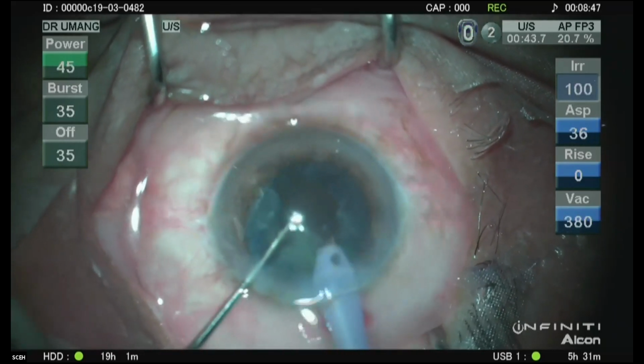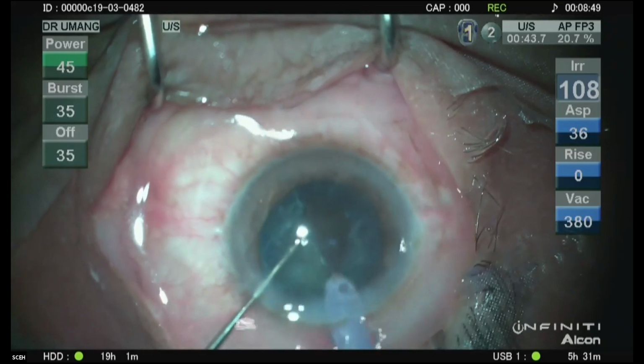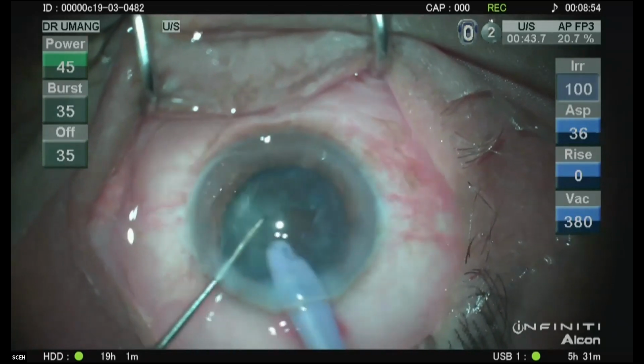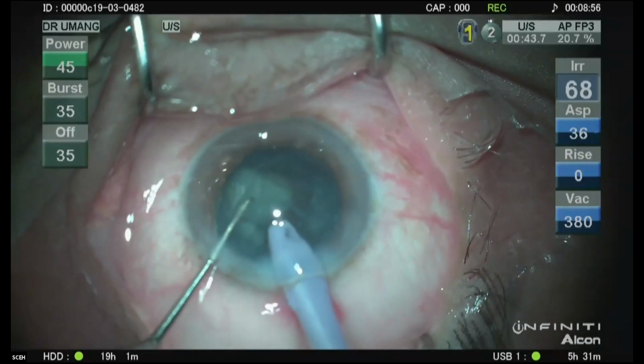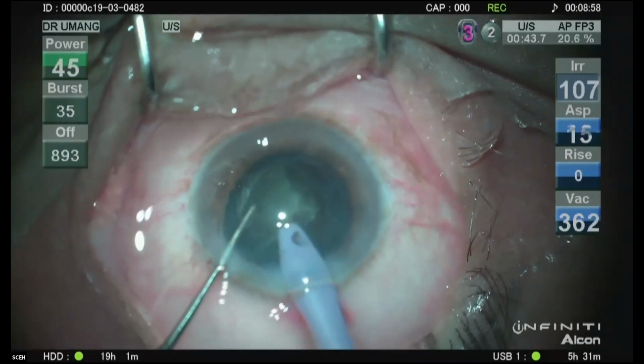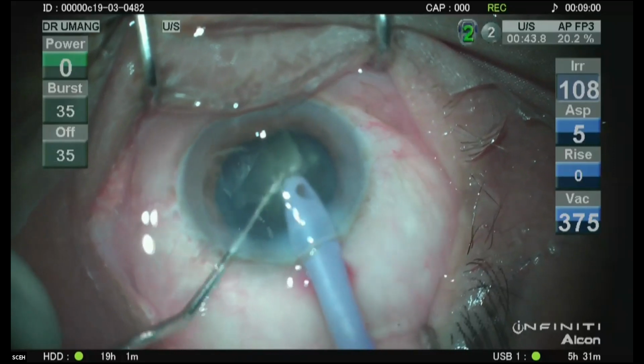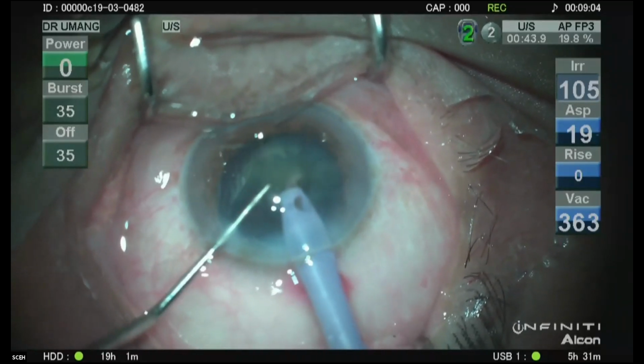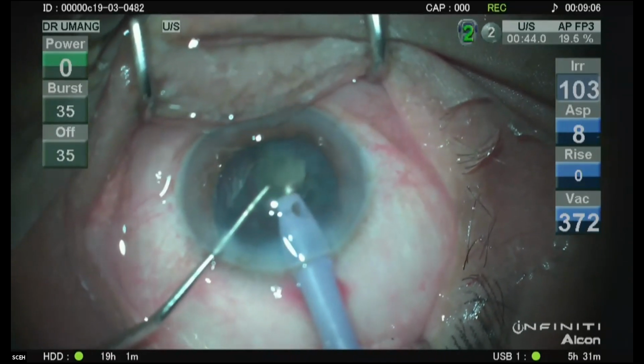And so, can you put some water on the cornea? So I'm now on my last piece, and so I should be slower. I don't want things to go too fast because I don't want any surge at this point.